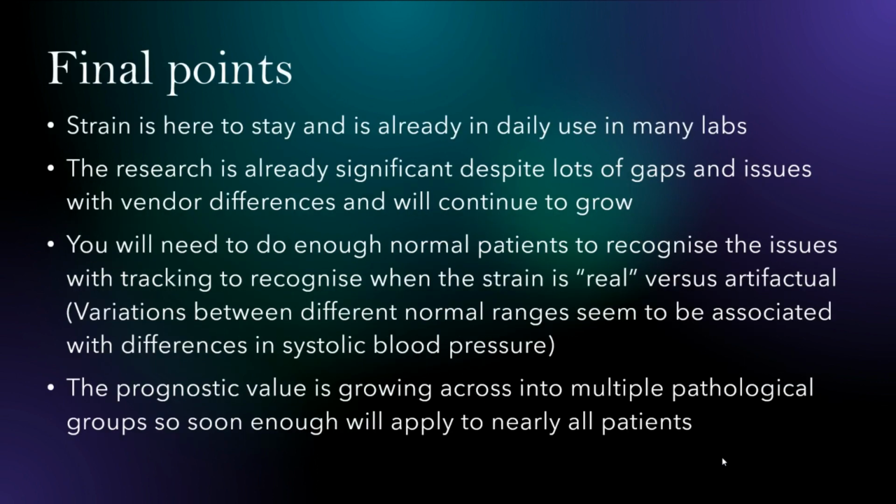So the final points. Strain is here to stay. It's already in daily use in many, many places. The research is already significant, but there are still lots of gaps and issues, particularly around the vendor differences. But you'll find it continues to grow, and some of these gaps will narrow.